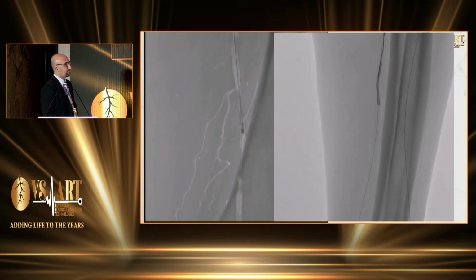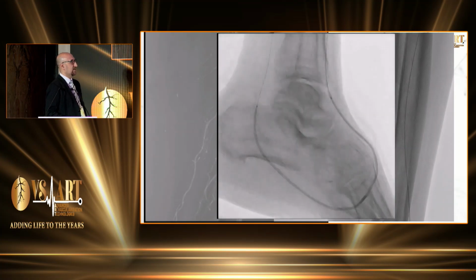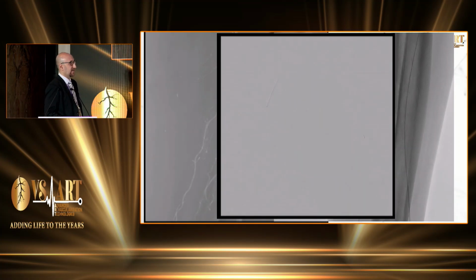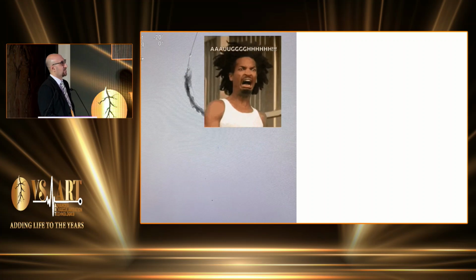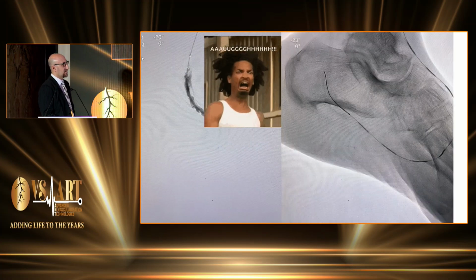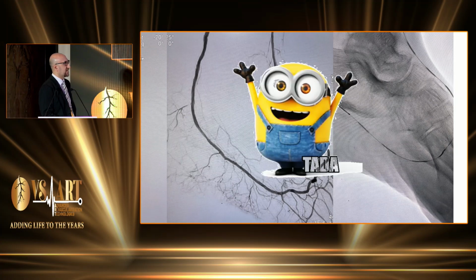Then we had at the end balloon dilatation of this heavily calcified area. And can we play this video, please? And we have a perfusion to the calcaneal branches, and this increased the perfusion to the calcaneus part. So we had this at the beginning, but we didn't give up. So we had this maneuver for the pedal plantar loop, and hopefully we have now this perfusion to the calcaneal area.